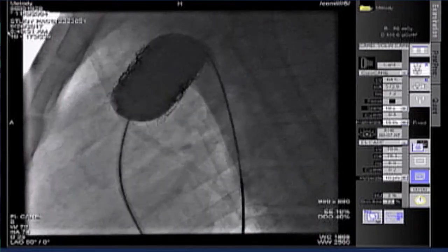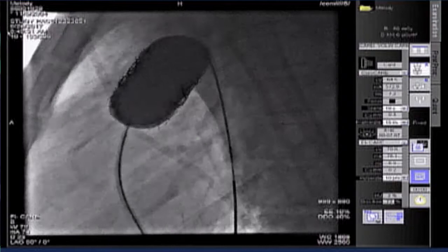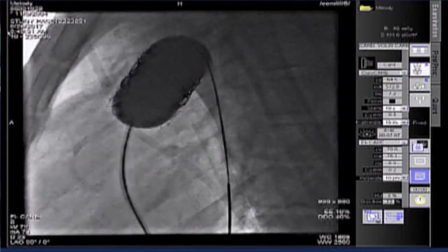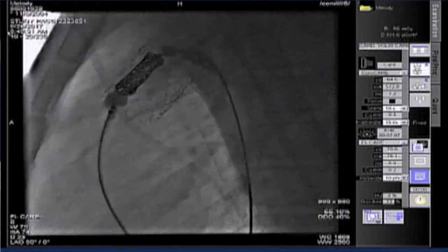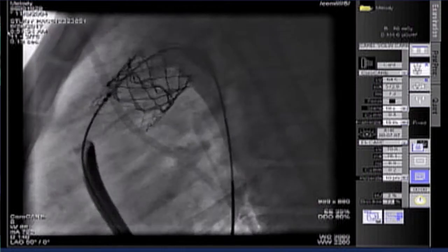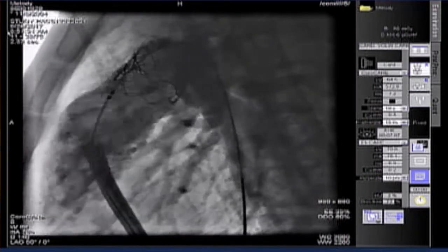Now, this is a BIB balloon, so the Ensemble mechanism is BIB. That means 22 BIB. If you push it a little harder, easily can go up to 23 without a problem. The next, I thought it was all right.